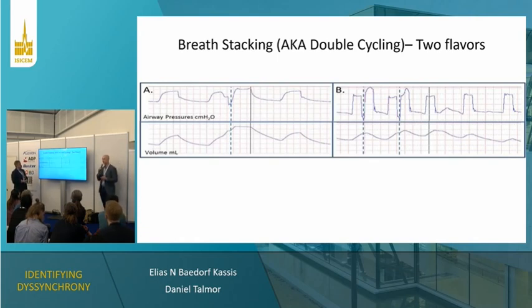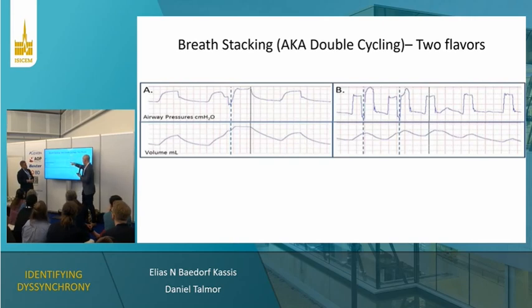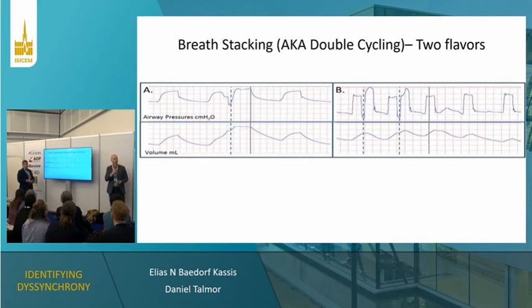So we already talked about double triggering, and then we talked about reverse triggering. And so the key differentiation point here is what we're seeing here, right? This is a ventilator-triggered breath initially. This is a patient-triggered breath initially, okay?